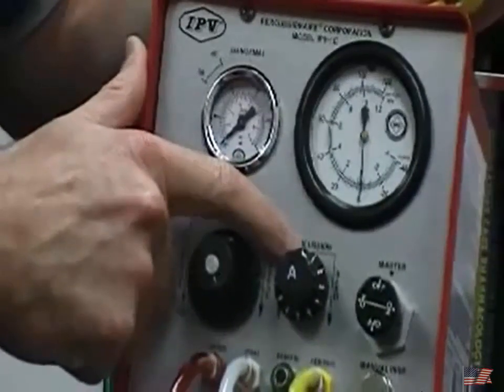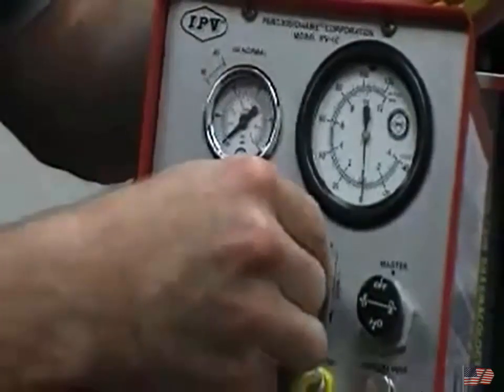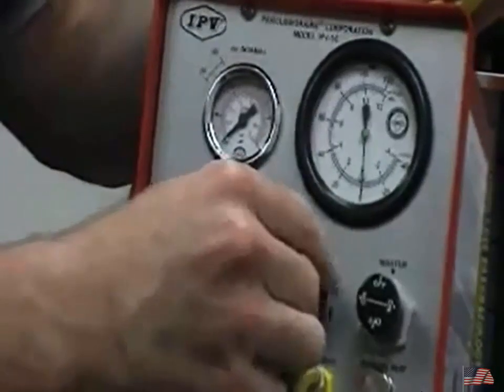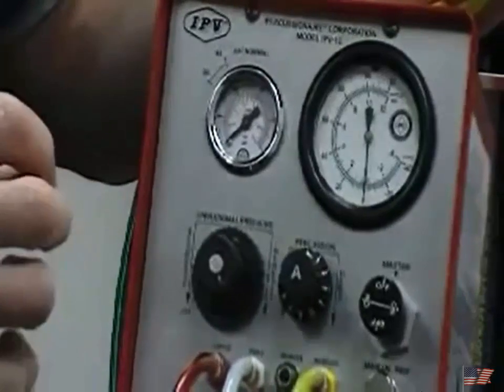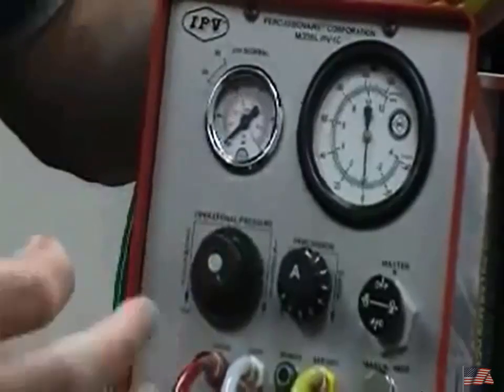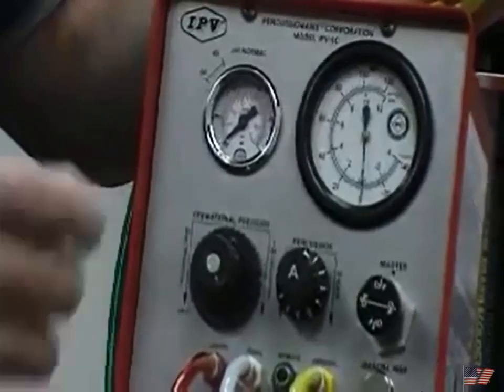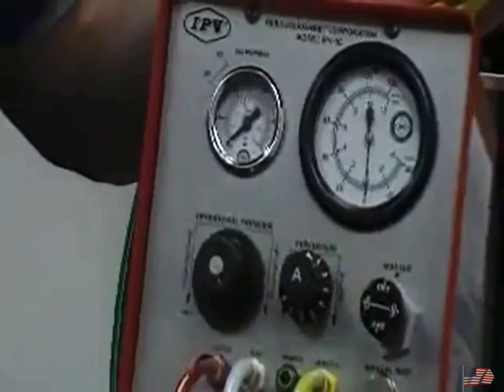I'll start there, and then as I start on my treatment, every minute or so, I'll just change my frequency level, both sides of that, because one section may work well with one certain section of the lung. Another frequency may work at another section of the lung. We don't know which one's going to work where, so we're just going to try and blanketly cover all of them. And this is simply the on and off switch of the unit, though.